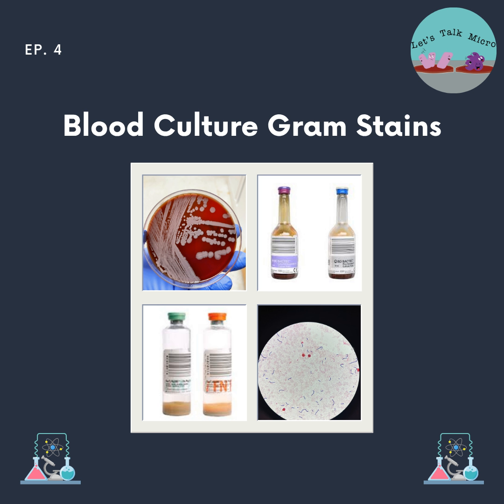But good thinking out there. If it's the same in both bottles, you only call the first one that's flagged as positive. Always making sure that you call it and you document everything properly.